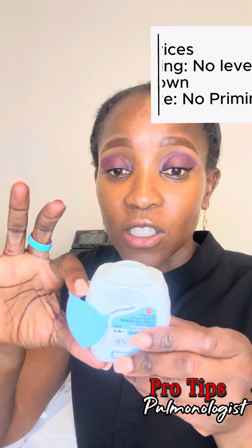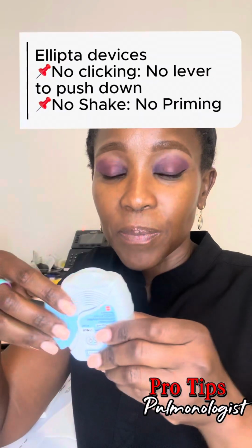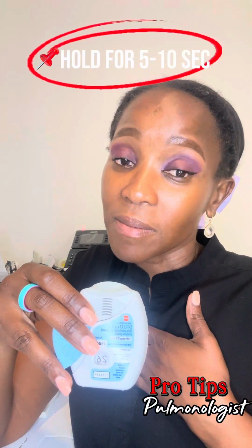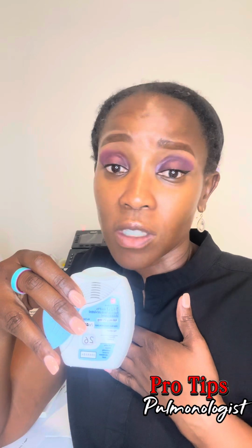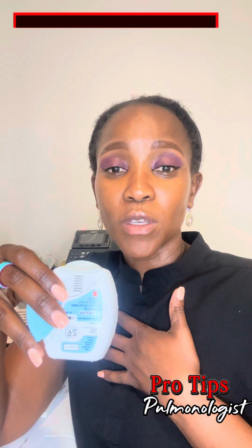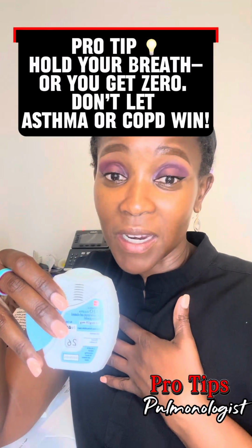And this has no clicking, no shaking. All you do is exhale, and then you take a deep breath in and hold it. Always exhale first, but if you have good breath, you can do it without exhaling. I like to tell you that you should exhale first, because most of you are holding a lot of air inside your lungs and you haven't completely emptied. So give yourself a full breath of very expensive medications, right? And that is the best thing to do.